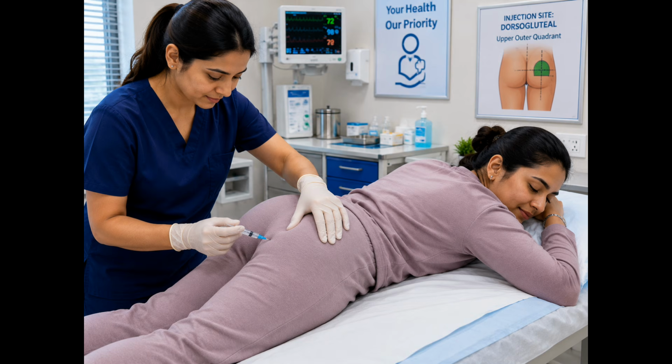After the medication has been administered, gentle pressure may be applied if appropriate according to clinical practice. The used syringe and needle are immediately placed into an approved sharps container without recapping. Safe disposal protects both patients and healthcare workers from accidental needle stick injuries.